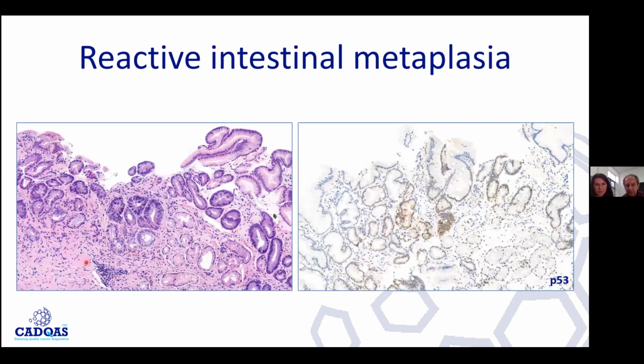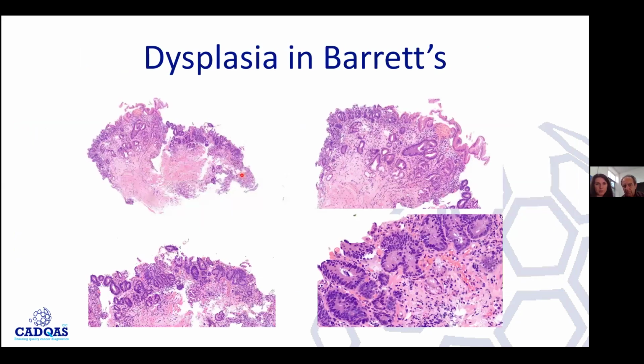And just a few examples. This was a focus on the H&E where there was intestinal metaplasia here, but these cells were a bit worrying, hyperchromatic. Unfortunately, the section is significantly deeper here, but the intensity is not high. We eventually said that this is possibly an indeterminate focus, but it has wild type expression. And then we weren't that worried.